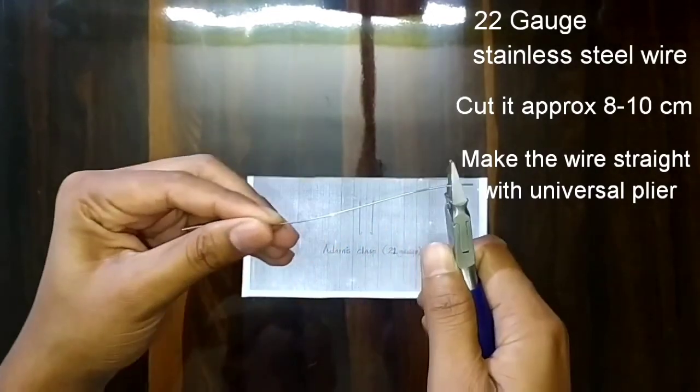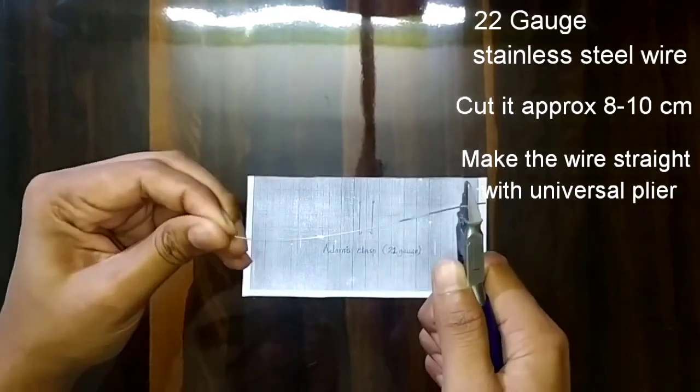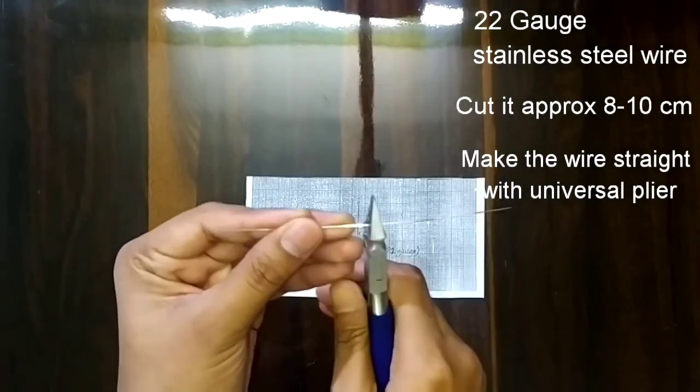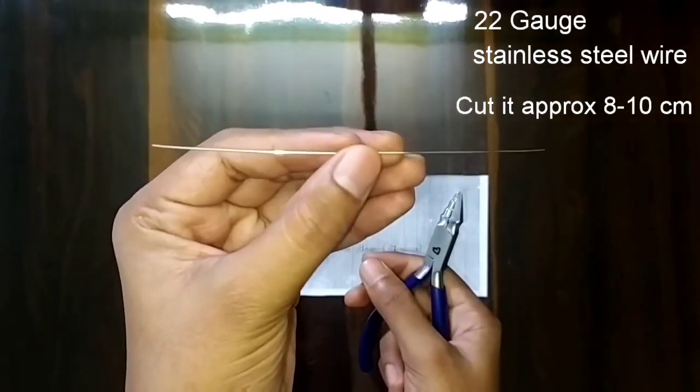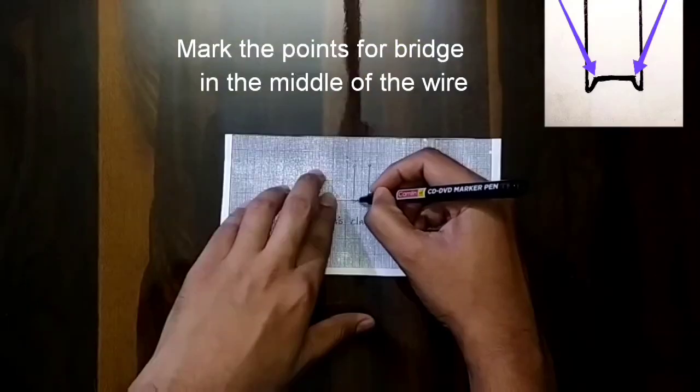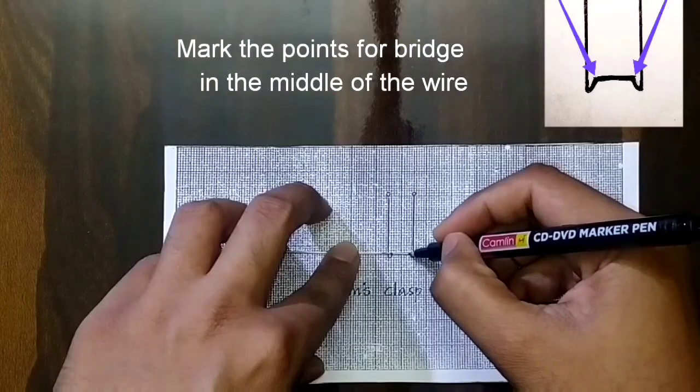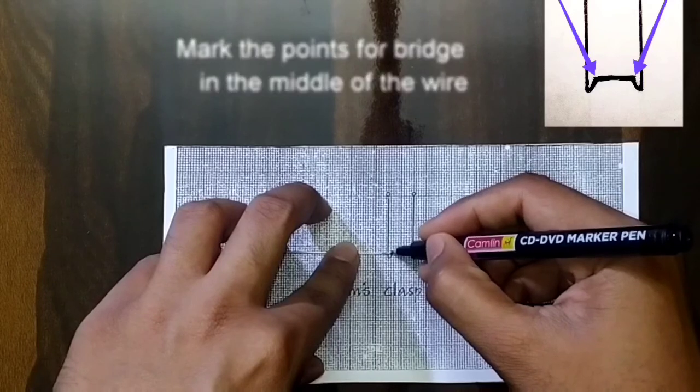Hold the wire at one end with the plier and apply pressure with fingers to make it straight. Now the wire is almost straight. After this, we will do the marking for the bridge. We'll mark on the middle of the wire.